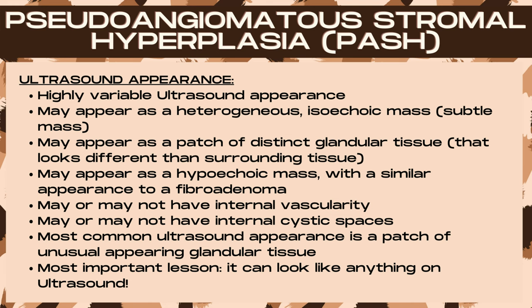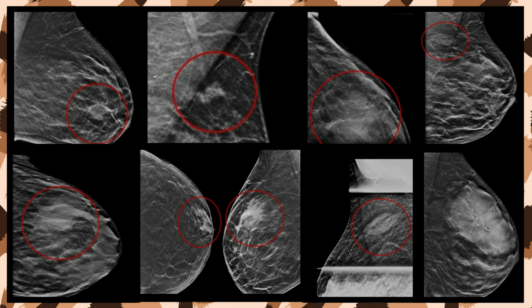The best way to find PASH is to compare the ultrasound with the mammogram and get a location of where you're looking. Although sometimes it appears as a mass on ultrasound and is more readily visible. On a mammogram, PASH appears as a distinct area of tissue — most commonly a patch that is either new or increasing and developing over time. Before looking for PASH on breast ultrasound, it's incredibly helpful to have the mammogram findings to correlate with the ultrasound.